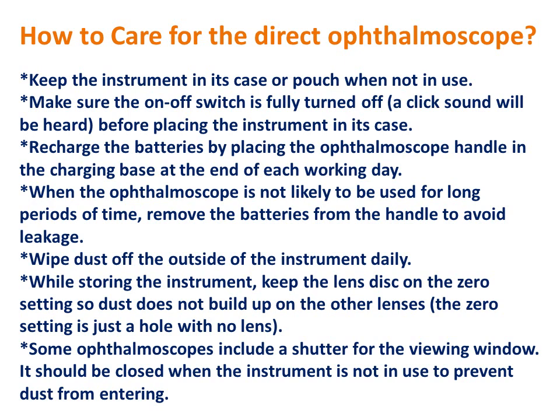Charge the batteries by placing the ophthalmoscope handle in the charging base at the end of each working day. When the ophthalmoscope is not likely to be used for long periods of time, as I told you earlier, remove the batteries from the handle to avoid leakage. Wipe dust off the outside of the instrument daily. While storing the instrument, keep the lens disc on the 0 setting.